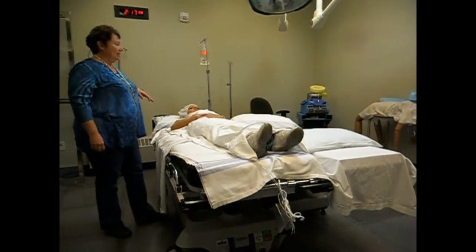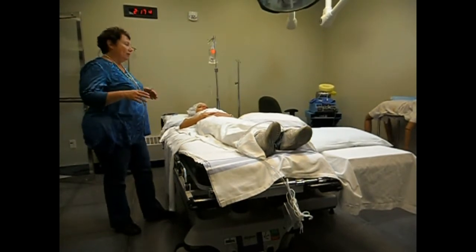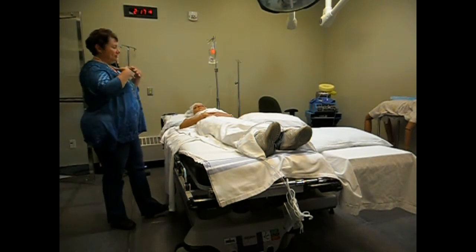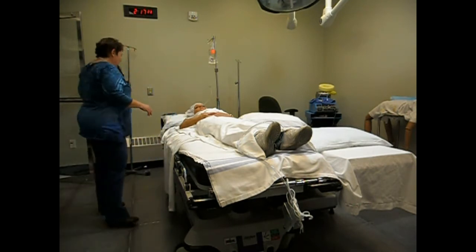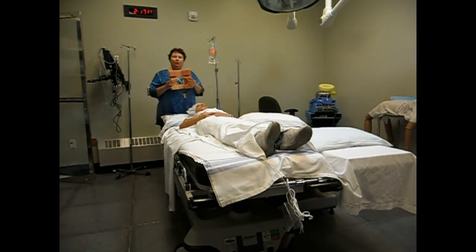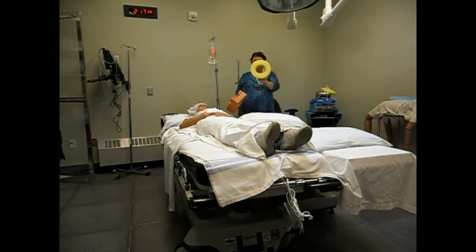Position now. And in this case, we're going to use pillows for support on our OR bed. We're going to have two, one around the chest area and one underneath the lower legs. For her face, we're going to use this foam crate. There's other things that we could use. We could use this type of device, whatever will work the best for your patient.